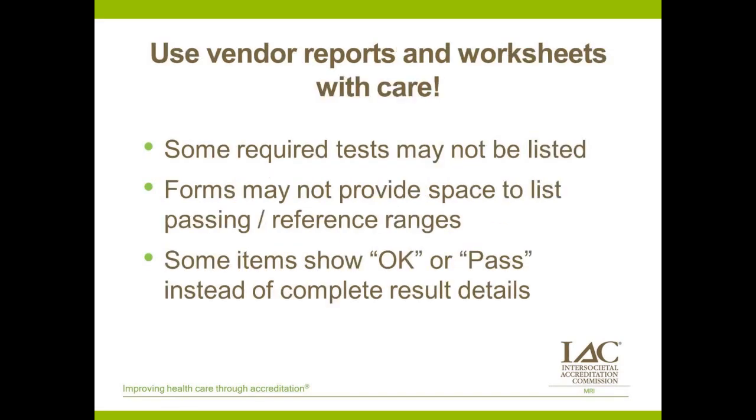I alluded to this earlier. You want to be very cautious when you pull a worksheet from your MRI system manual, or you take a report from a PM visit from your field service engineer and say, okay, I'm required to have a PM done. Here's my PM report. I'm good. You want to go through that report, keeping the information from this webinar and from the IAC standards in front of you, and take a look and see that that documentation really meets all of those criteria.